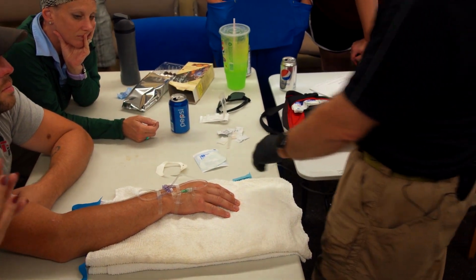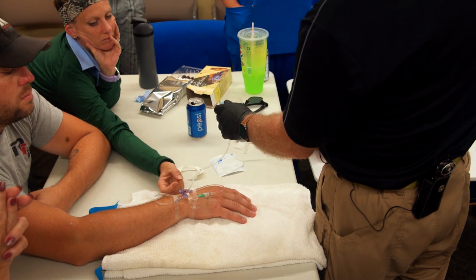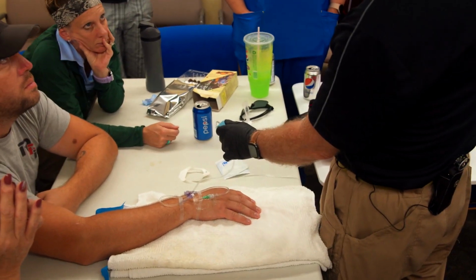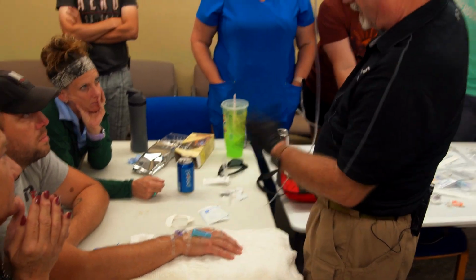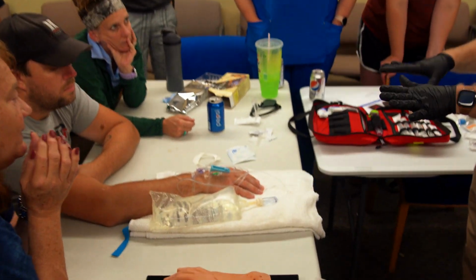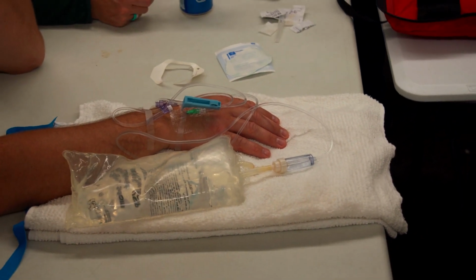You do, but for just a little bit, so you've got it hanging either up on your IV thing or on the IV pole on your cot, right? So now, just before we go in, maybe we don't have a good place to put it, or maybe we're transferring them over to the helicopter. So for just a minute, we turn it into a very large saline lock, and it's not going anywhere because it's completely shut down. Just for the transfer, and then we bring it back up and start it back up. Or if you're handing off, then, hey, it's locked off.